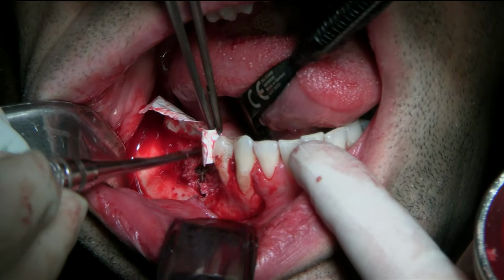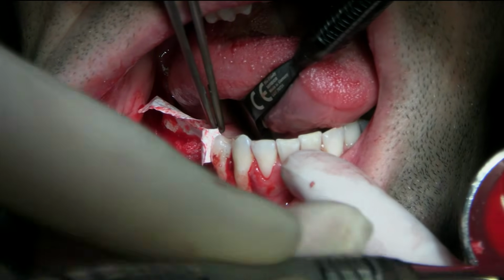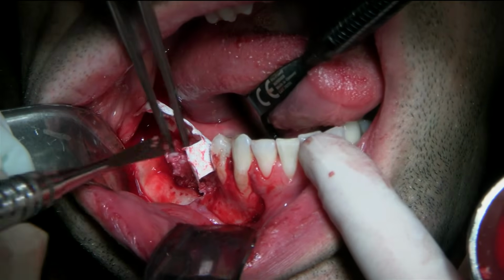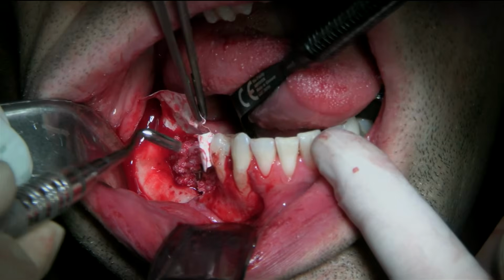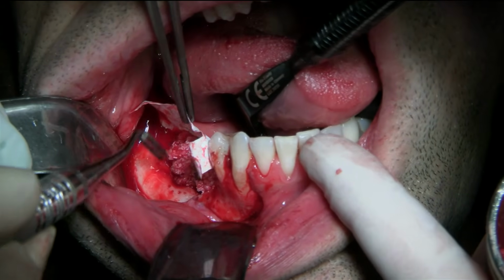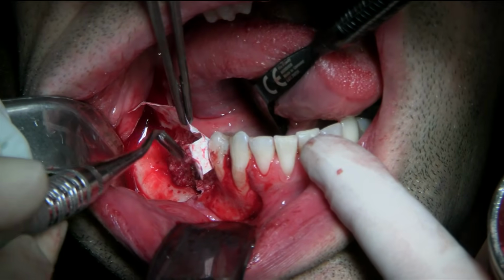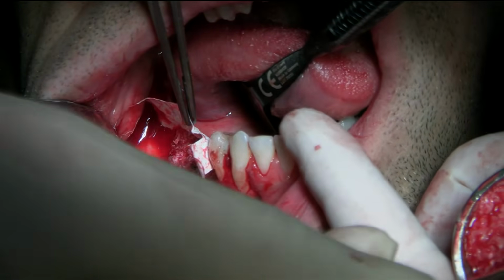I did a study many years ago, the very same technique, but just with a blood clot. Even with a blood clot for small defects, the bone can grow underneath the membrane. So the scaffold that we're giving makes it just more powerful. But you definitely want to get blood in there, which we did the perforations for.